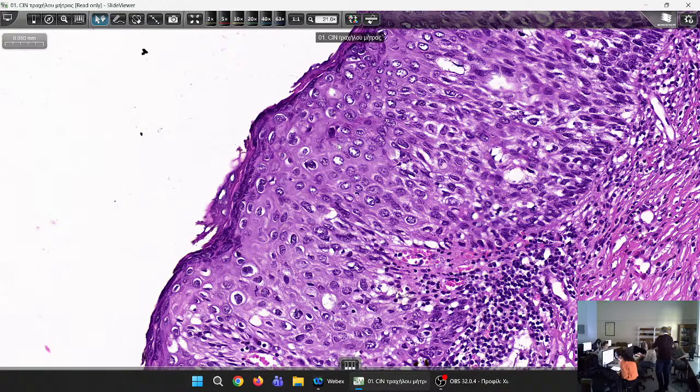And of course there is a clinical significance in this distinction, because if the woman has low-grade dysplasia, you do nothing. You do nothing. You just have the follow-up and you check with pap smears to see if there is some progression from low-grade squamous intraepithelial lesion to high-grade, because this is the more imminent of invasion, high-grade dysplasia, high-grade squamous intraepithelial lesion. So if you have on histology, on the biopsy, low-grade, you just do the follow-up of the patient.